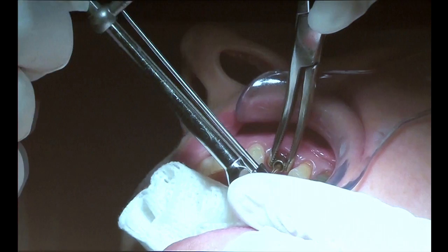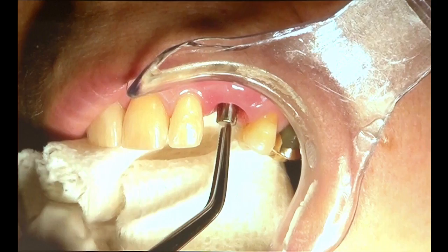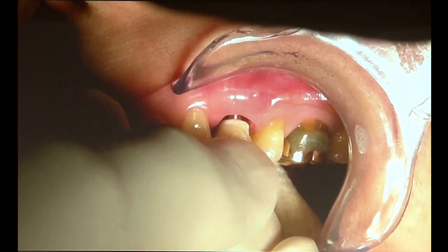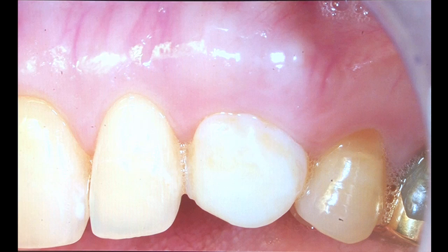And again, this is quite an easy matter to perform. And as you can see, it really takes less than 10 minutes from start to finish to take that second measurement. And it's a valuable measurement to take because, again, it allows you to track or follow the rate of integration that is occurring.